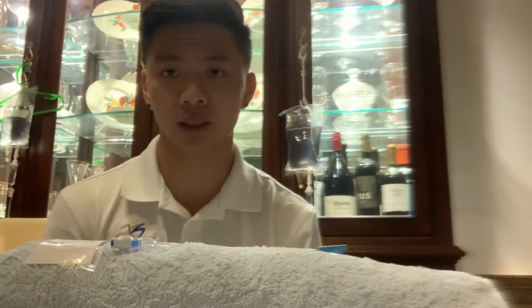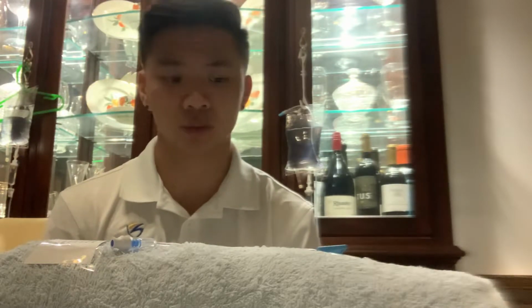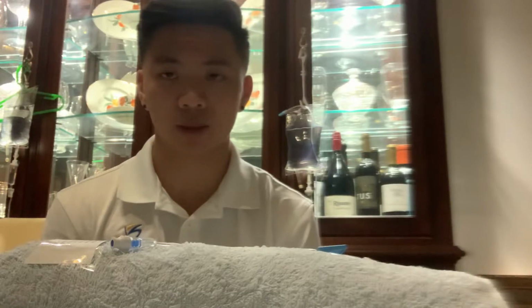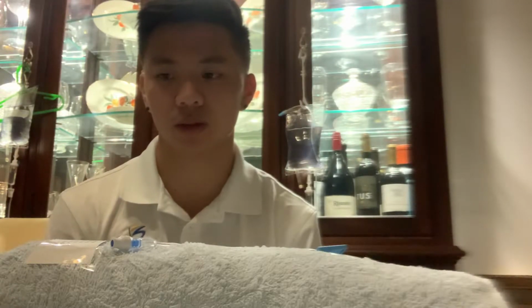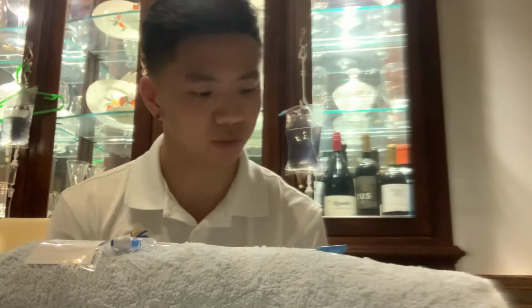I'm gonna go ahead and label the bag with the dose, which is 125 milliliters per hour, the drug, which is 0.9% sodium chloride, time, which is 14:58, my initials, and the route or the date, which is May 11, 2020.